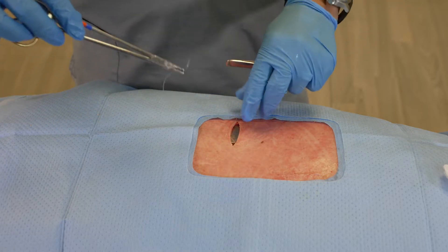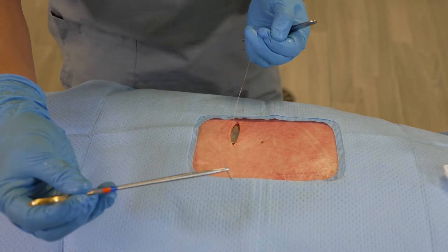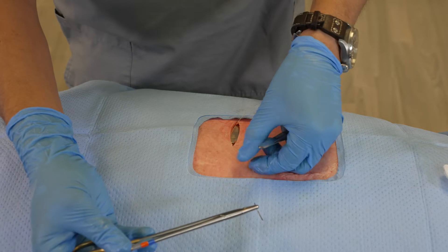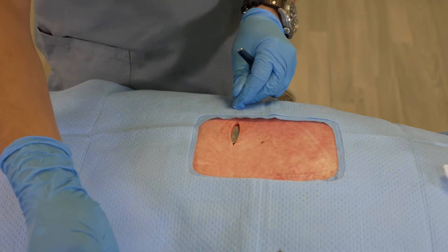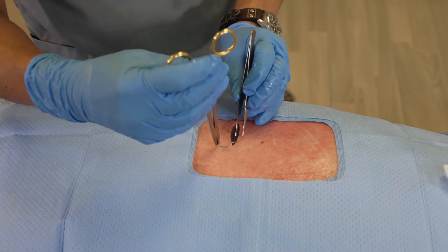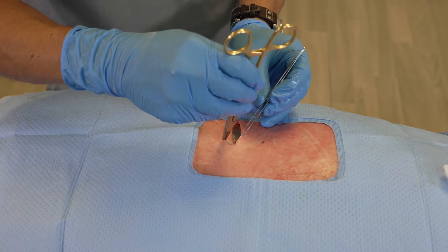Once we've done that, you can see here — if I try to pull in this direction, the suture does not pull. But when I pull in the forward direction, the suture does pull. That's because those small barbs are actually preventing it from being pulled in the reverse manner.